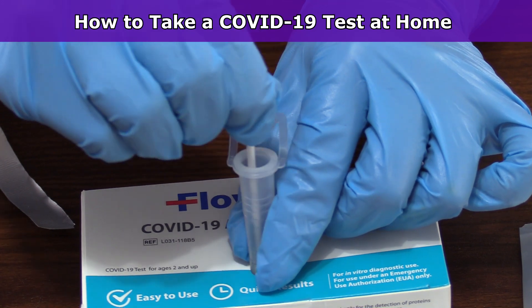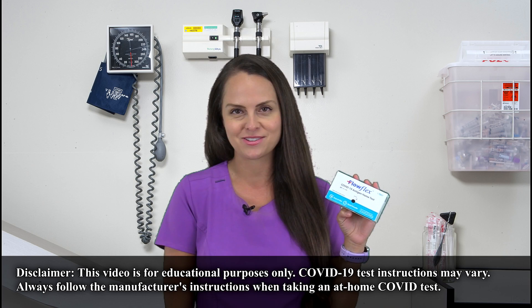Hey everyone, it's Nurse Sarah with RegisterNurseRN.com. In this video, I'm going to demonstrate how to take a FlowFlex COVID-19 antigen home test. So let's get started.